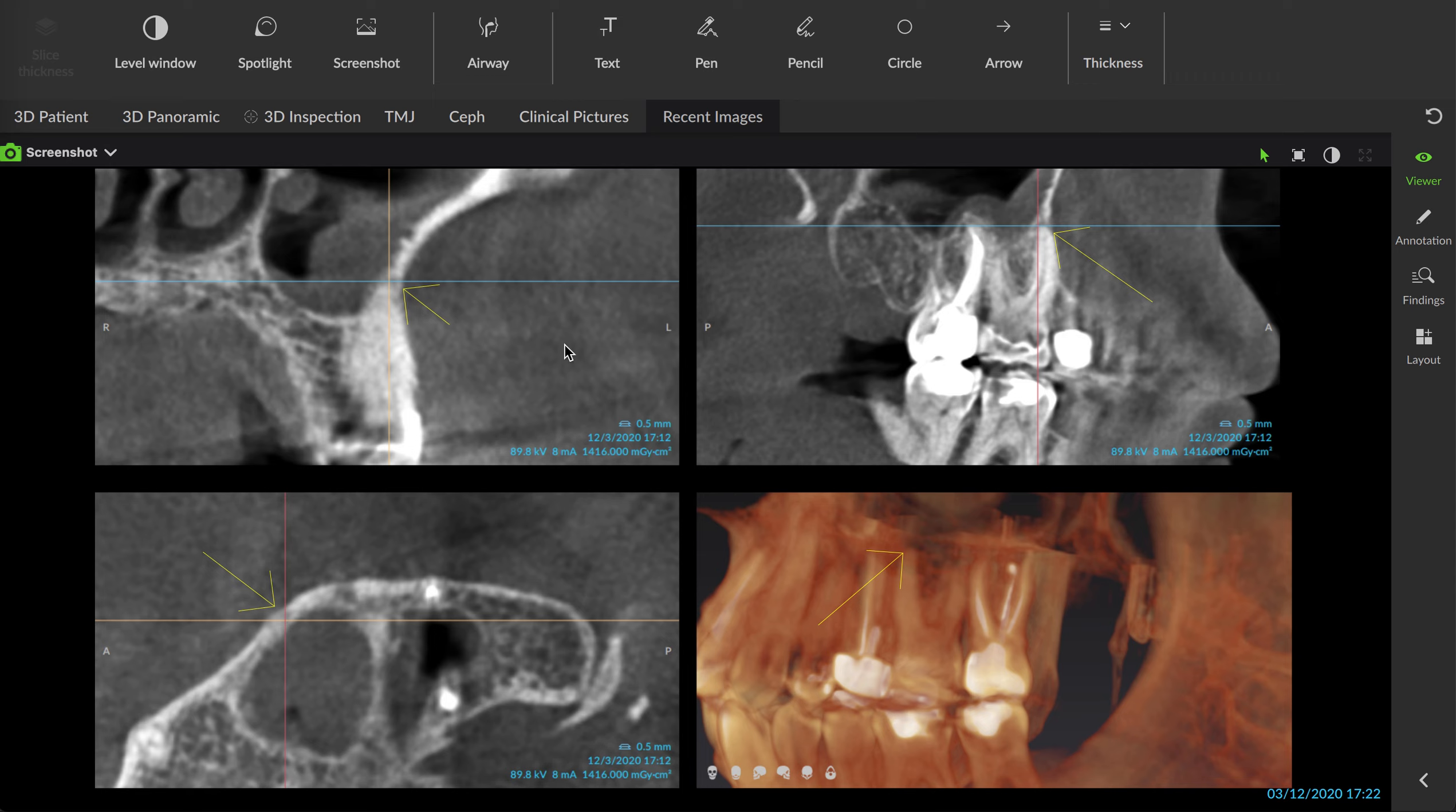Widening the PDL space, and then look at all this thickening of the mucosal tissue in the sinus. He wasn't aware of any sinus issues, but this area up in the sinus adjacent to tooth number 14 was dramatic thickening, widening there.